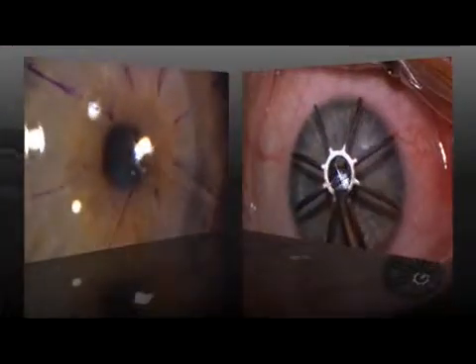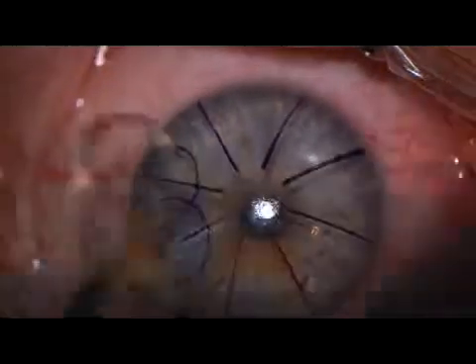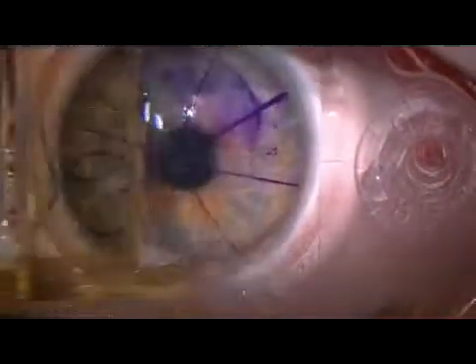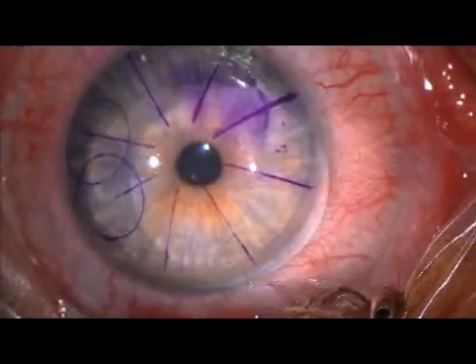Surgery proceeds in a similar fashion for the other eye. Note the microkeratome's dial — this is set based on Moria's nomogram, which includes K readings and the desired hinge cord length.